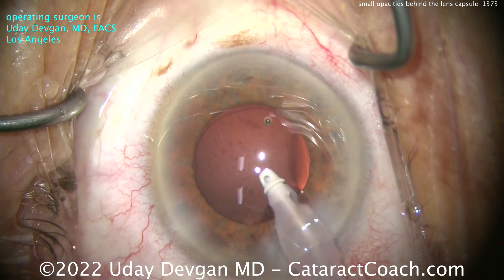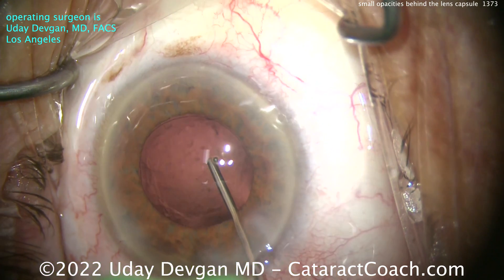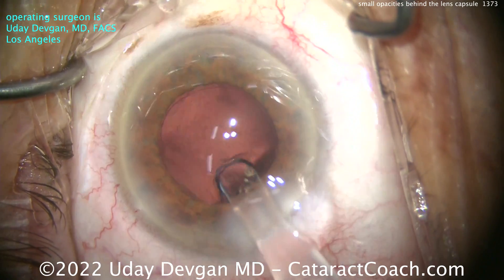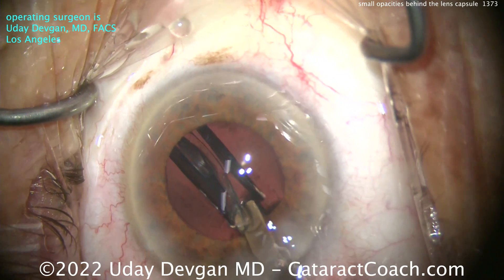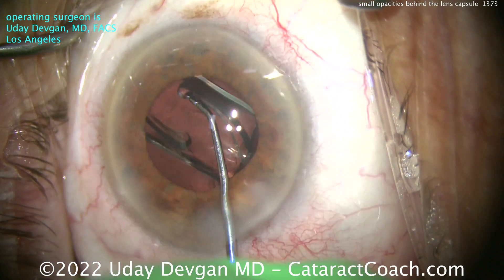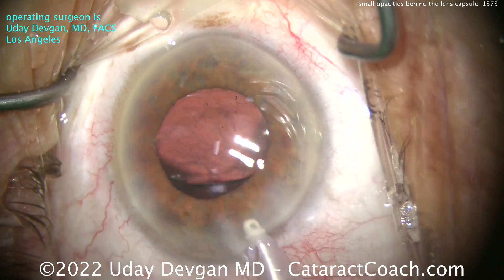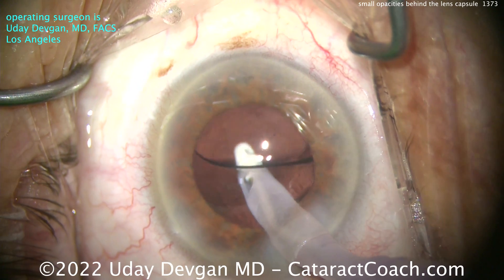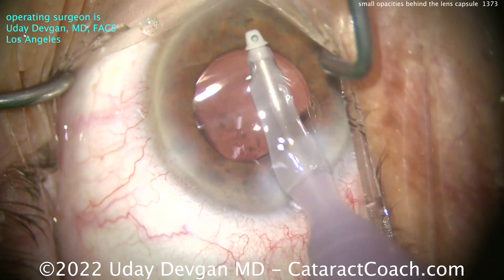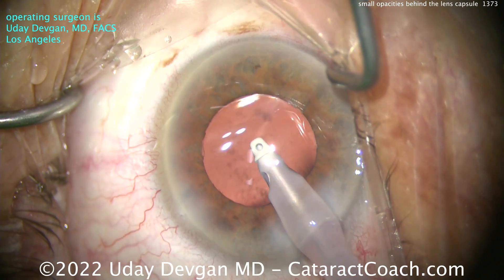Now looking back there, I'm kind of pausing. Let's put some viscoelastic there — look at those little flecks of pepper, like pepper flakes. I'll fill the bag with our viscoelastic, and you can look back there — those pieces are a little bit mobile. They're literally resting in the anterior hyaloid face, between the anterior hyaloid face and the back surface of the posterior capsule. Regardless, let's put the lens in the capsule bag. Here comes our IOL — let's get that delivered and placed securely within the capsule bag. I've sensed no zonular weakness during this case; there's just some permeability of that zonular support. That's why when we had infusion pressure in the eye with a high flow rate of 30 to 40 cc's a minute, we can sometimes push some of these emulsified tiny little fragments of lens material into that space. So we're cleaning up our viscoelastic here — and looking back there, look at the little pepper flakes you see on the anterior hyaloid face behind the posterior capsule.